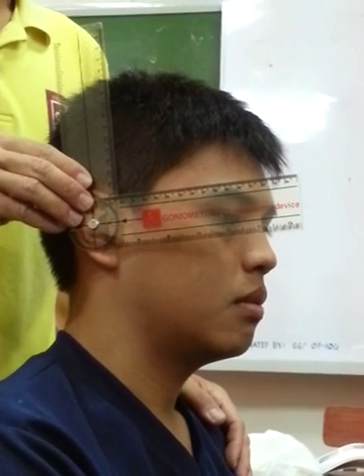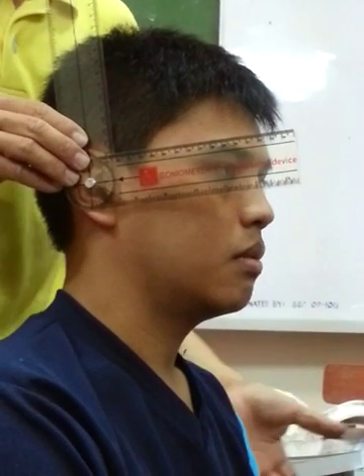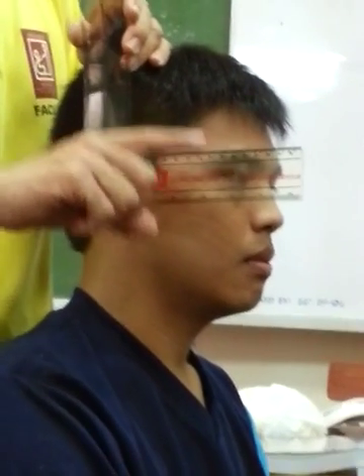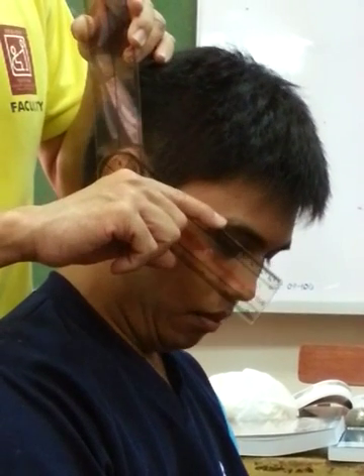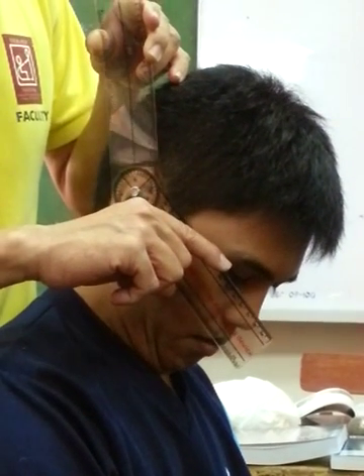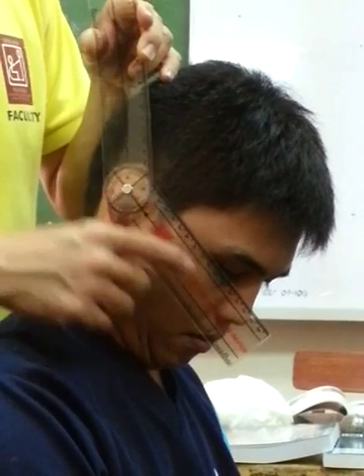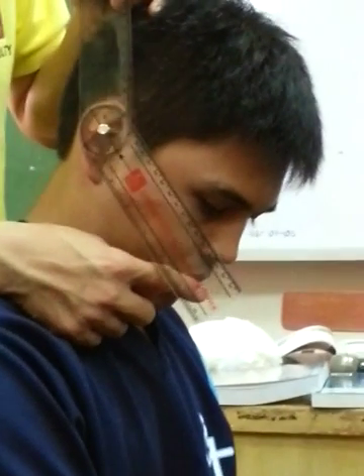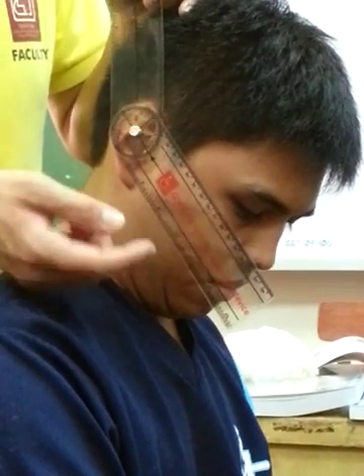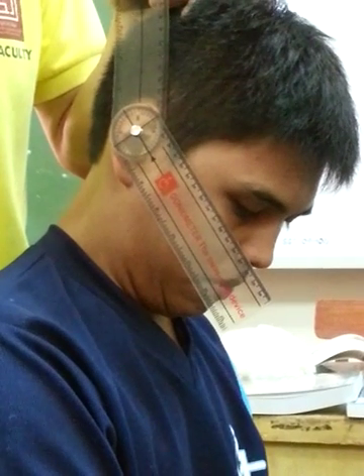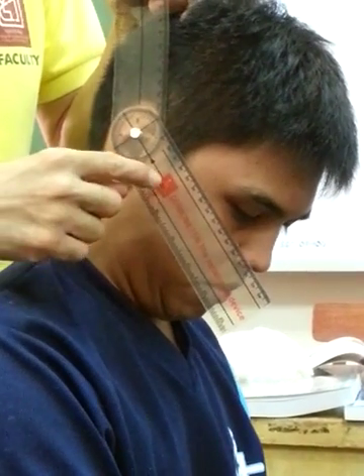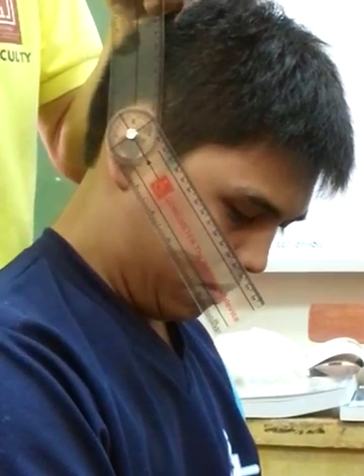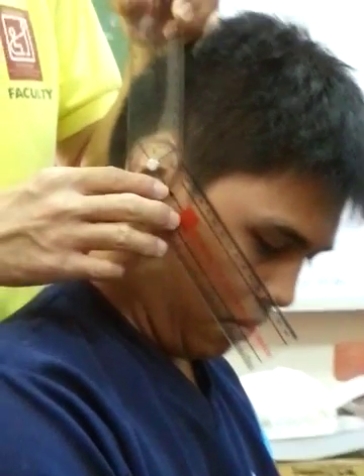After placing the goniometer properly aligned, tell the patient: I want you to bend your head and neck as we discussed, after the count of 3 — 1, 2, 3. The distal arm follows and is aligned to the base of the nose. Your stationary arm also stays in position.